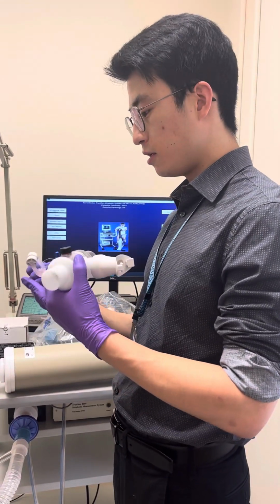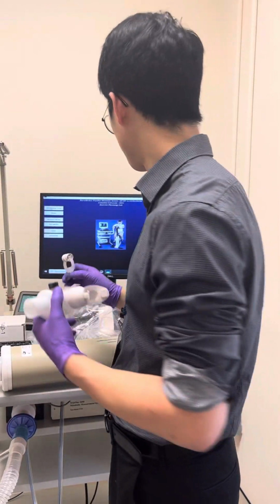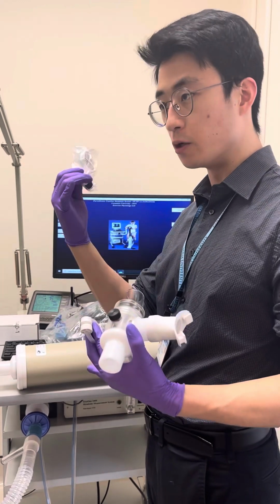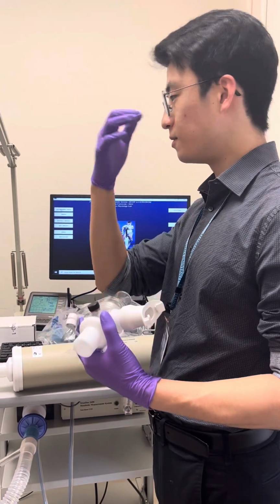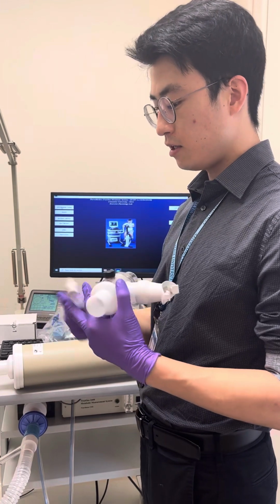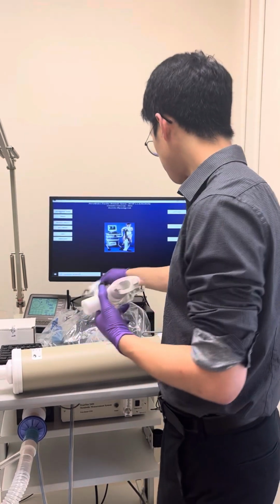I personally like this a little better because you need 2 hands for that one, but this you just need 1 hand. And then I also brought you a couple of heavy-duty backups. Some people just have larger noses, or some people have more slippery noses, or it might be kind of hard to use this. So in those cases, just use the heavy duty. These are disposable. These you just clean with alcohol and use a few times.